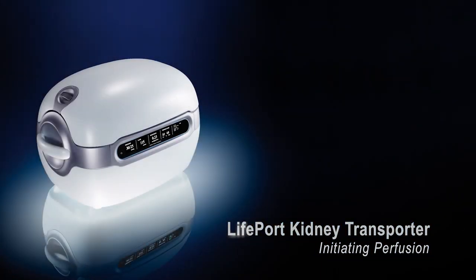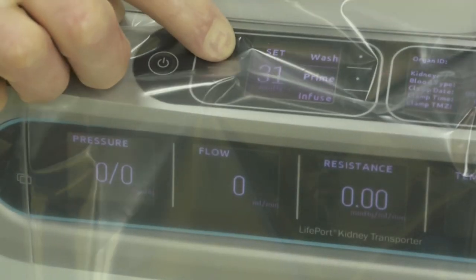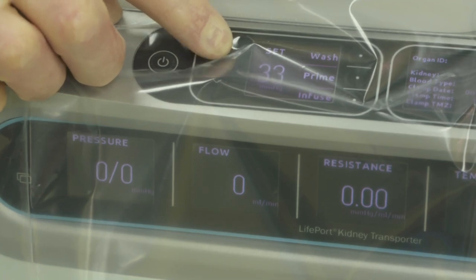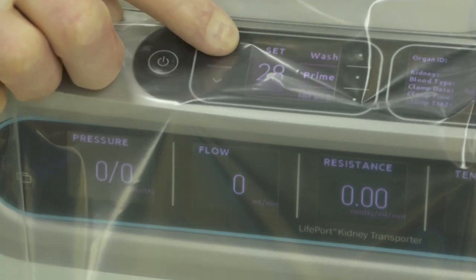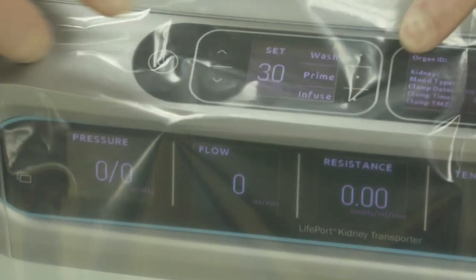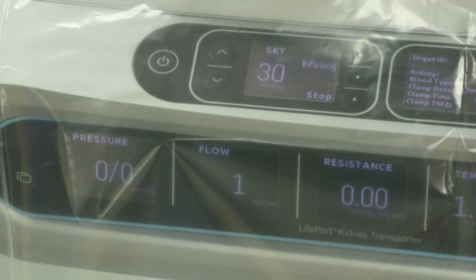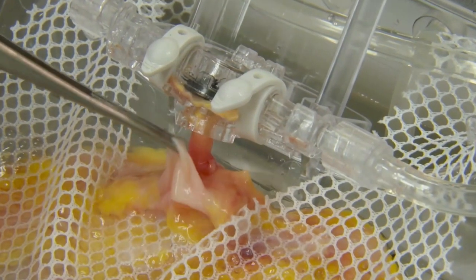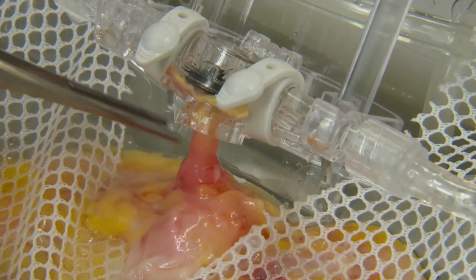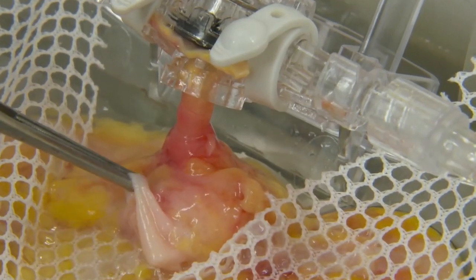Initiating perfusion. Before infusing the kidney, you can change the pumping pressure using the up and down arrows, although the default is 30 mmHg. Then press the infuse button to start the infusion process. Visually check for leaks around the cannula, ensuring that the artery expands after infusion. You can also check that the perfusate or any residual blood is exiting through the vein. As perfusion continues, you will be able to see the color of the kidney change to a more pale state.